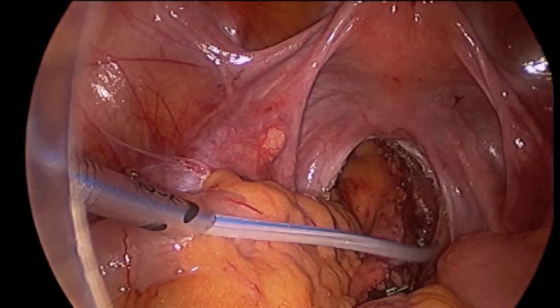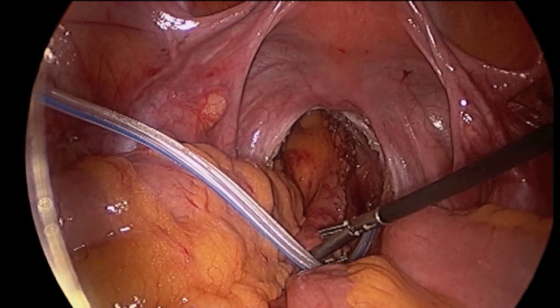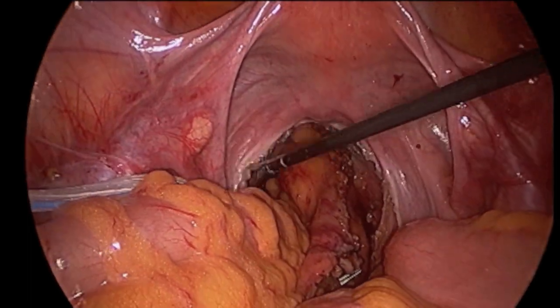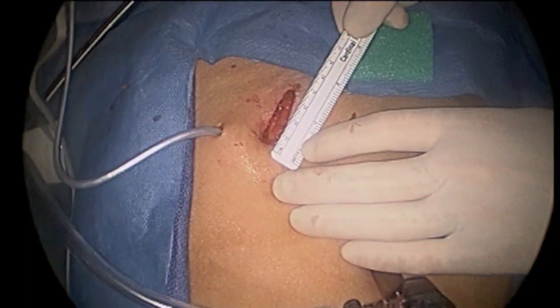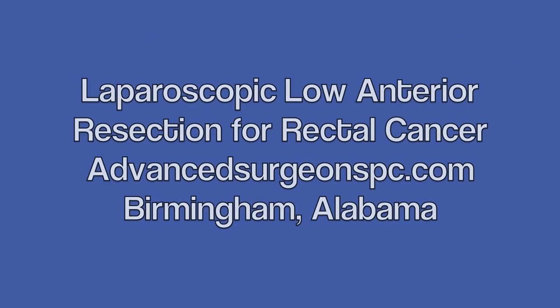The fluid is suctioned out and a small drain placed in the pelvis to prevent fluid buildup. The three small incisions are then closed with absorbable sutures, thus completing the operation.